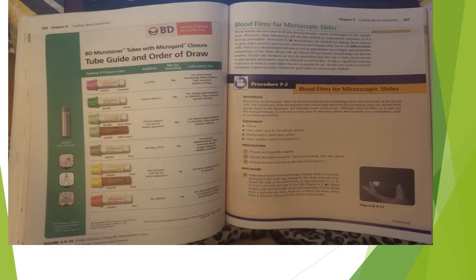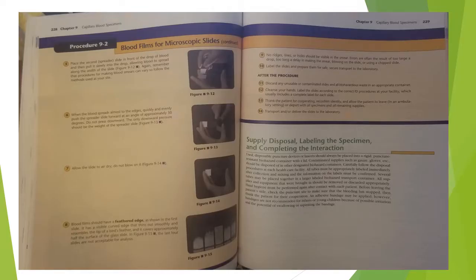Blood smears may also be made using anticoagulated EDTA blood from a lavender top tube. However, it should be done where there is minimal exposure to blood or blood spills. Place the second spreader slide in front of the drop of blood and then pull it slowly into the drop, allowing blood to spread along the width of the slide. Again, remember that procedures for making blood smears can vary, so follow the methods used at your site.